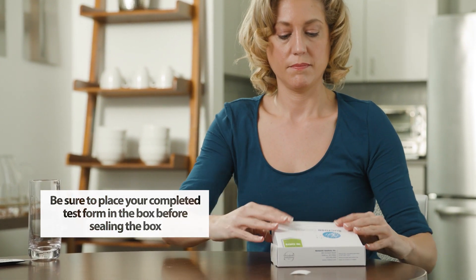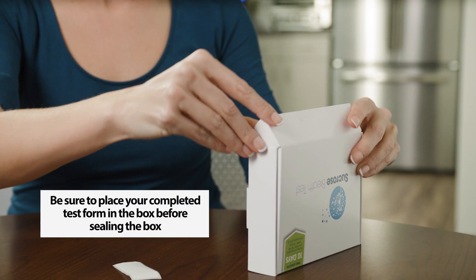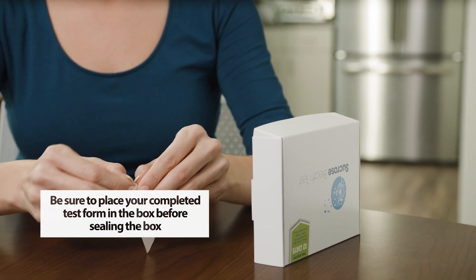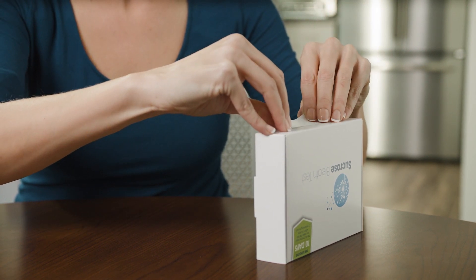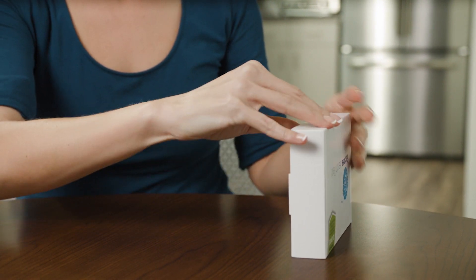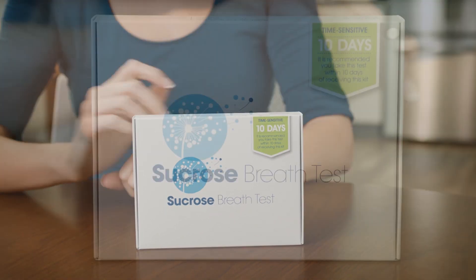It is important to note that all fields must be completed to receive test results. Your form must be placed back inside the box before sealing closed for shipping. Use the white seal in the box to seal the completed test kit. Once your test is securely sealed, your kit is ready to be shipped. There is a USPS return label adhered to the back of the test kit. Place the completed kit in your mailbox or any other USPS drop box.